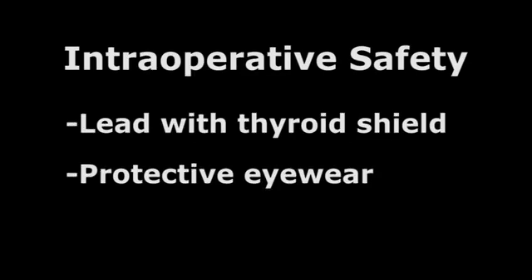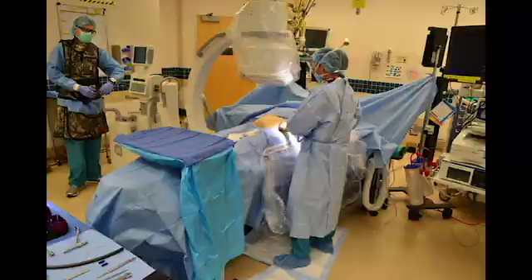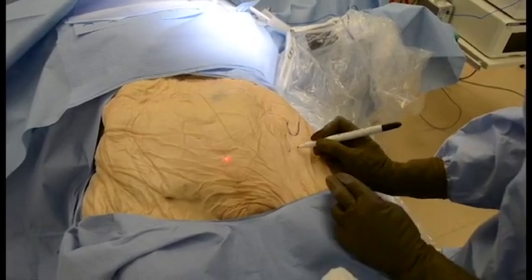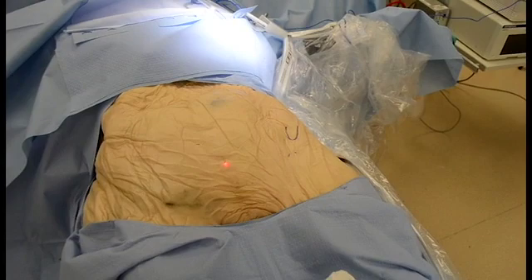Procedure. All intraoperative staff should be wearing lead and appropriate eye protection at all times. We recommend fluoroscopy comes in from the contralateral side of injury with the image intensifier over the top — this decreases radiation exposure to the surgeon. In most scenarios you do not need to drape in the legs; you may consider draping in the legs for higher energy injuries. We also recommend ioban to the inguinal region. Palpate the ASIS. Find the AIIS approximately 2 cm distal and 2 cm medial to the ASIS. Keep in mind that the patient's anatomy has been disturbed from the injury — your hand position will need to start more laterally as the pelvis tends to be externally rotated with these types of injuries.